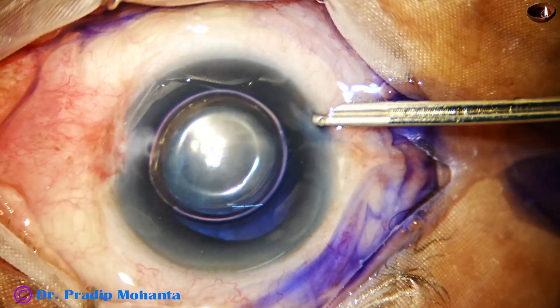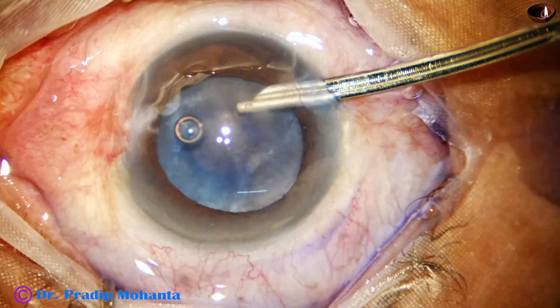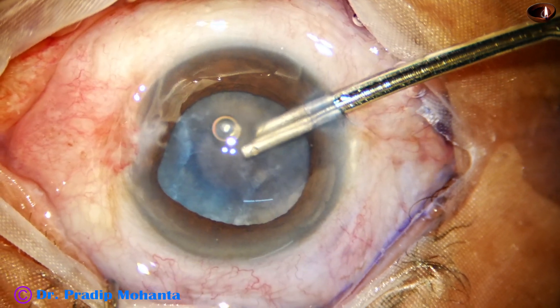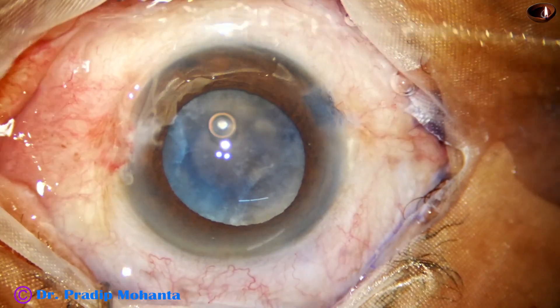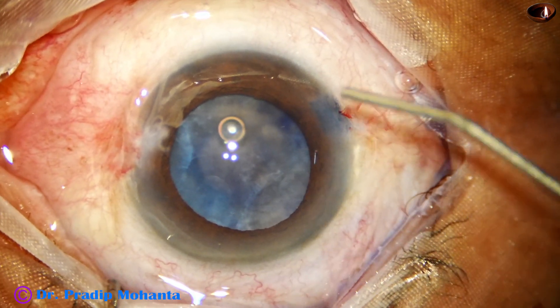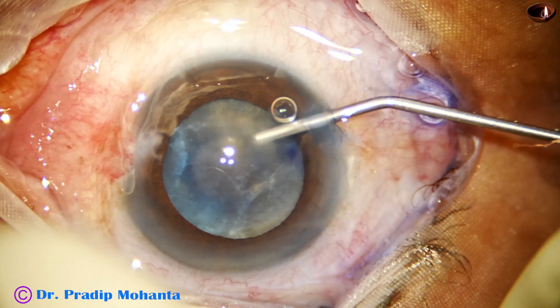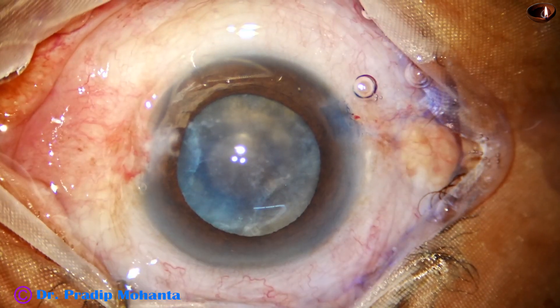A little bit of adrenaline is applied so that the dilatation of the pupil is maintained. I wash the dye out, remove the excess dye immediately, and then fill up the anterior chamber with 2% hydroxypropyl methyl cellulose.